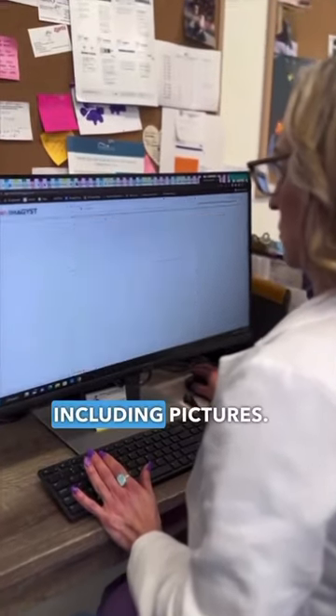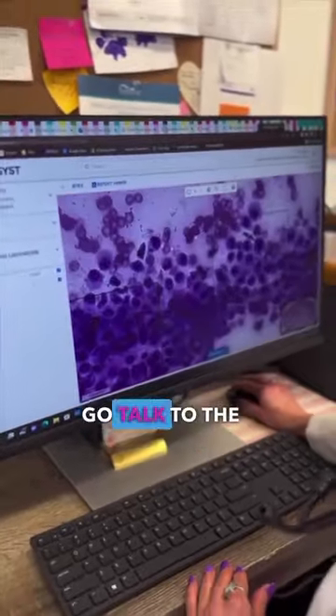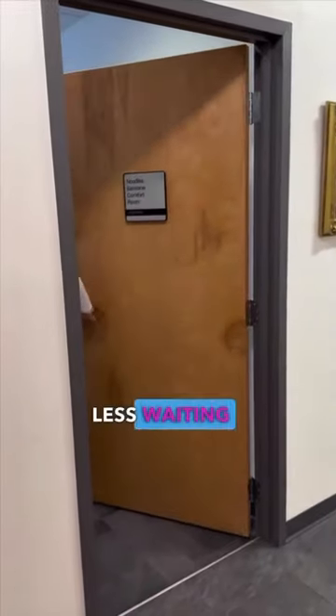Then I can review the report from my board-certified clinical pathologist, including pictures. This allows me to have these results and go talk to the owners while they're waiting — which means less waiting.